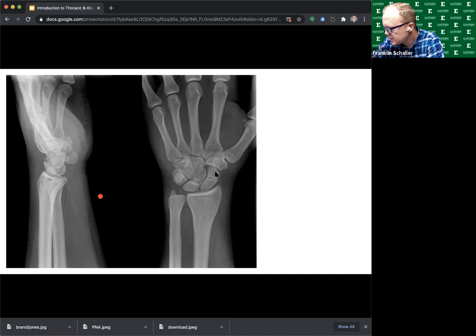It's scaphoid. It's called the scaphoid bone, okay? So again, there is a fracture through and through the scaphoid bone here. So it's not all about that radius and ulna when somebody has wrist pain or anatomical snuffbox tenderness. You've got to pay close attention to the scaphoid bone as well. So this patient has a scaphoid fracture.